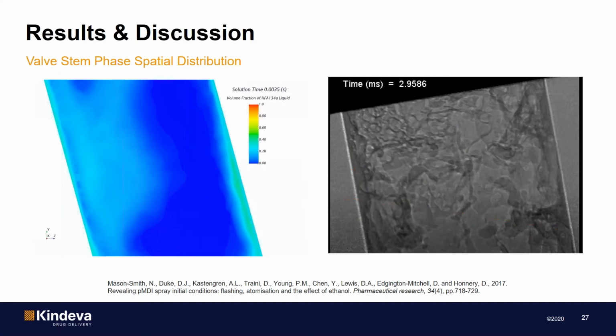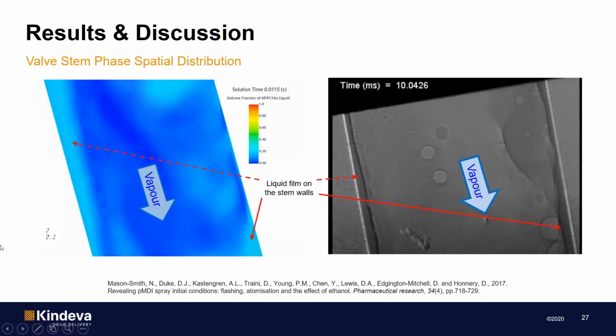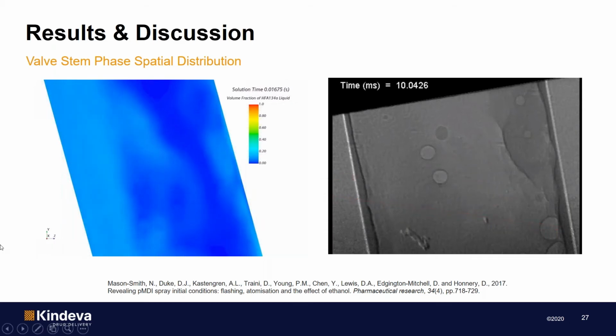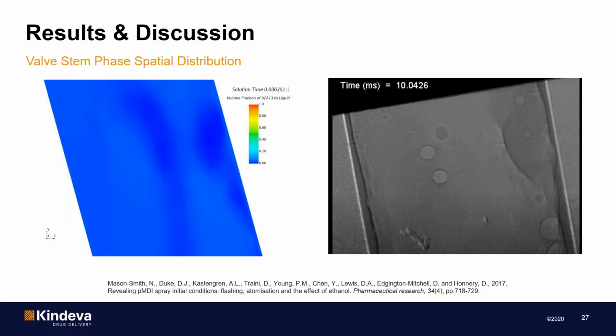And this is also observed in the phase contrast images, as you can see on the right-hand side of the slide. Now, again, moving forward in time, as the actuation time proceeds, the existence of the wall film becomes even more evident in the CFD, as you can see also in the phase contrast images. So moving forward from here, towards the end of the actuation, the CFD model again predicts that the wall film almost disappears and the mixture becomes predominantly vapor-rich and homogeneous.